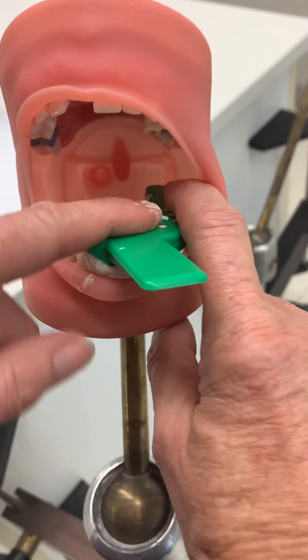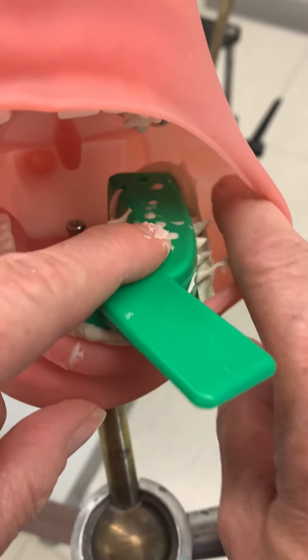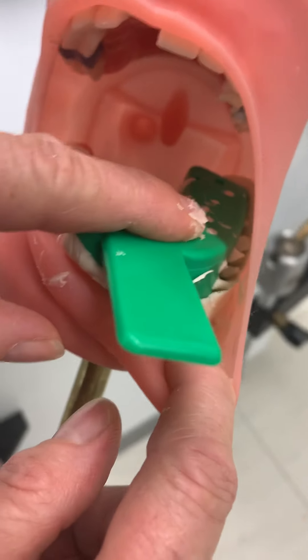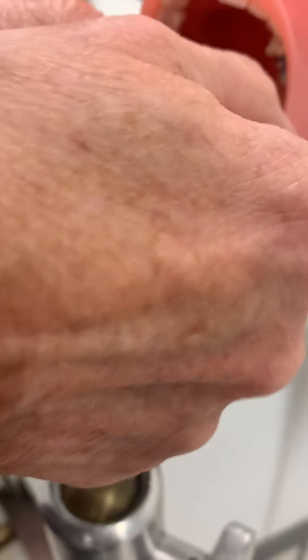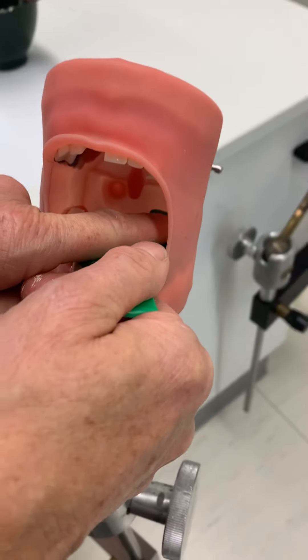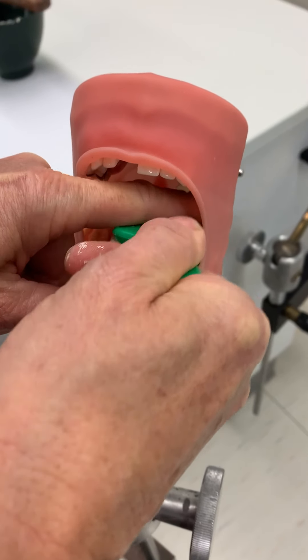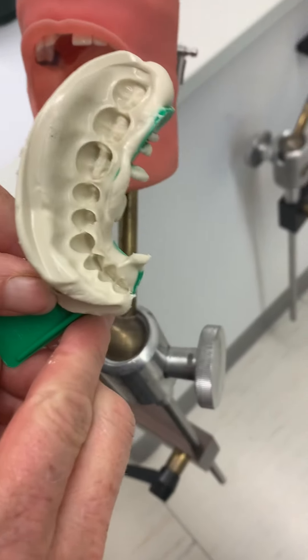It seems like our alginate is ready. I'm going to loosen the suction by taking my finger and going right alongside underneath the tray. Then in one motion I'm going to lift up — and it should come out. And that's our impression.